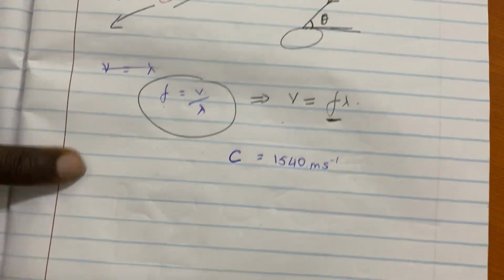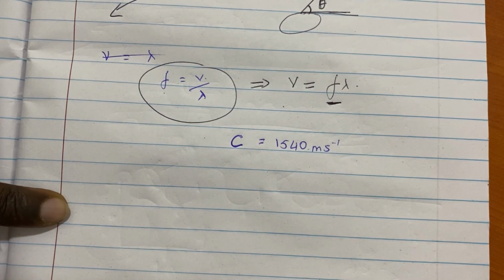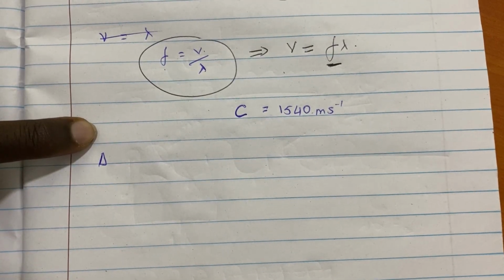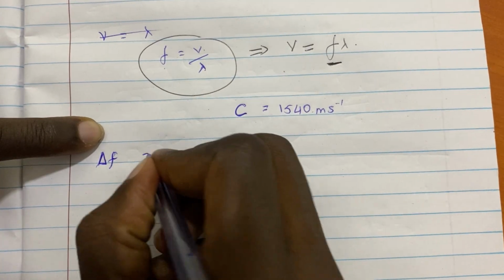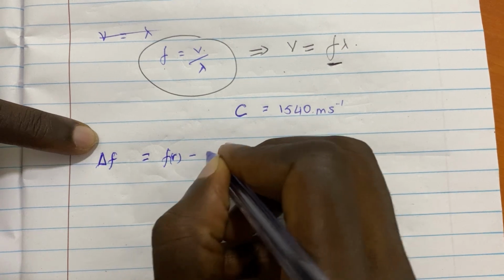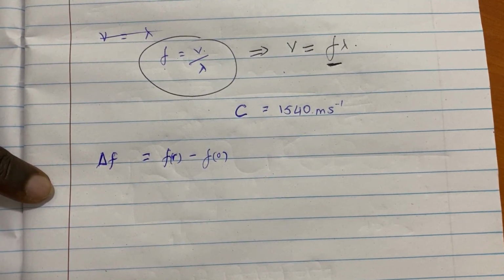So what we are going to do is to relate all these into one equation, because that's what we want. And then we see why we do Doppler. We have Doppler shift. Remember, we said Doppler shift is a change in frequency. Doppler shift delta F is equal to, we already gave it here, FR minus F naught. Yeah, that is a Doppler shift.